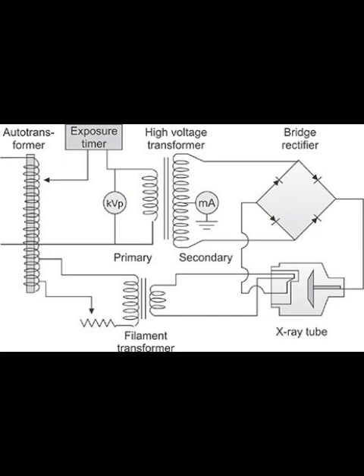Okay, so three-phase is generally better for consistency. What about pulse? You mentioned that earlier with rectification. Right. A pulse in this context is basically each burst of electrons that gets produced as a result of the rectified AC cycle. Remember that full-wave rectification uses both halves of the AC cycle. Yeah, flips the negative part over.